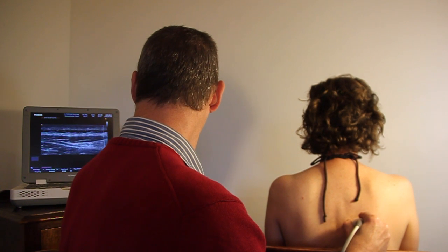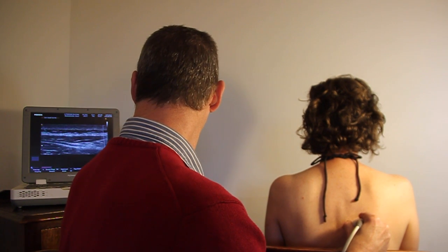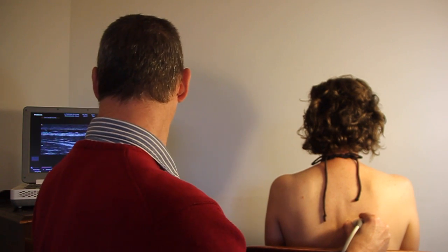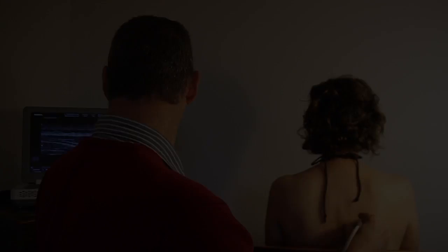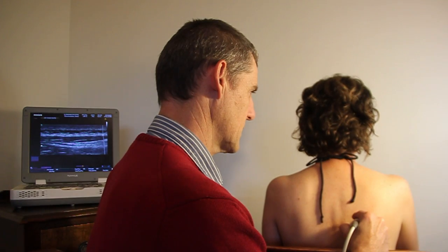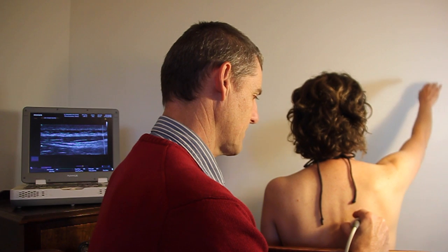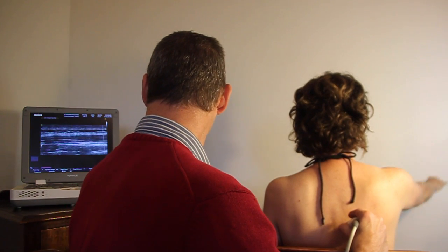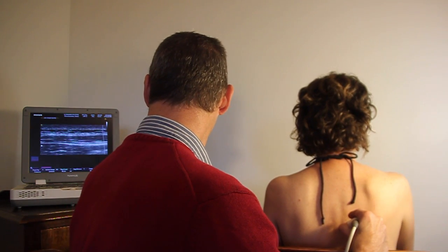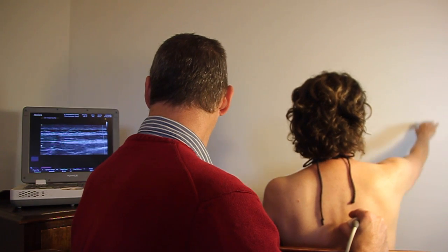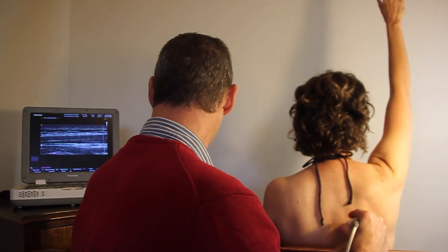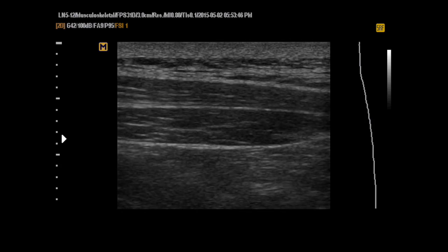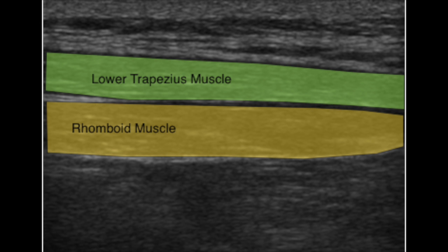Scan just medial to the scapula to view the lower trapezius muscle overlying the rhomboid muscle. Now assess the degree of muscle thickening during arm elevation and at which stage of the elevation the activation occurs. Here we see the lower trapezius at rest, clearly visualized between the white fascias.